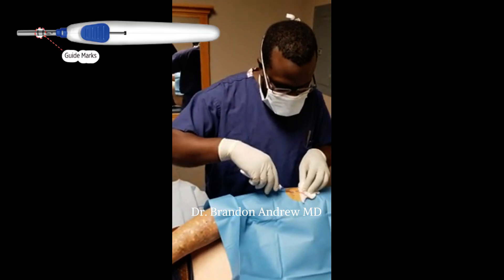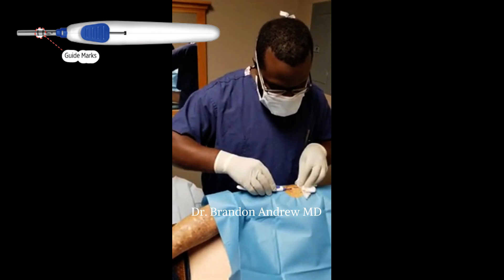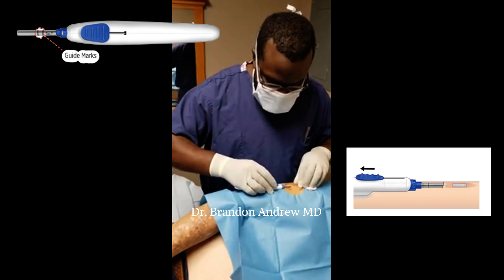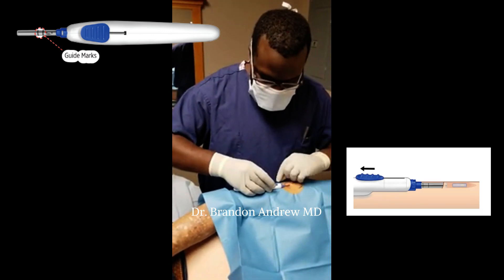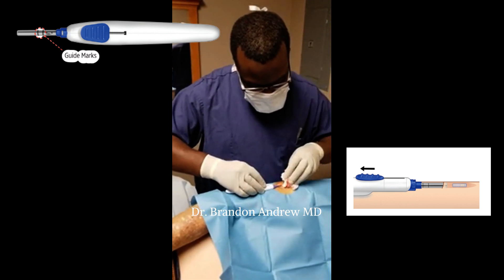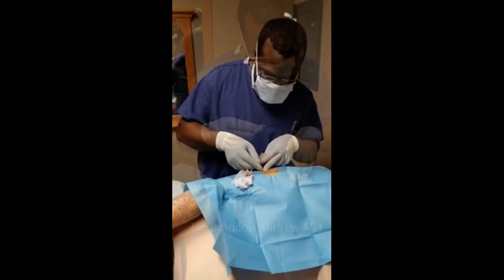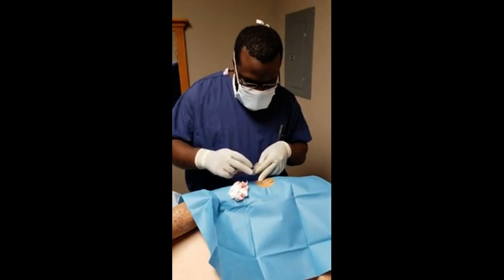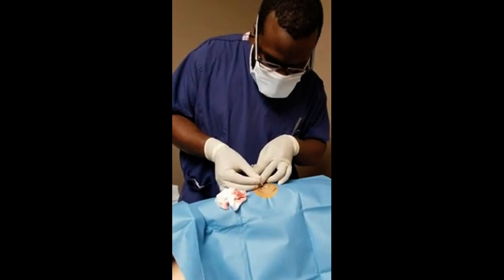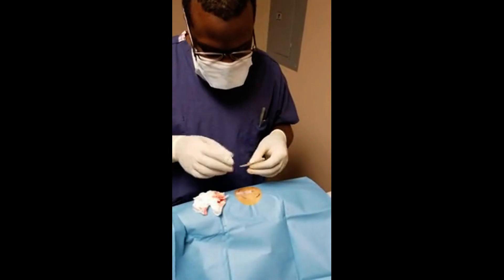Now, using the insertion tool containing the sensor, insert the cannula into the incision, lower your hand parallel, and advance into the pocket created by the blunt dissector. Then retract the slide to deploy the sensor into the pocket. Confirm visually that the sensor is no longer in the cannula, and confirm by palpation that the sensor is seated nicely in the subcutaneous pocket. Finally, place steri-strips and dressings. The insertion procedure takes about five minutes.